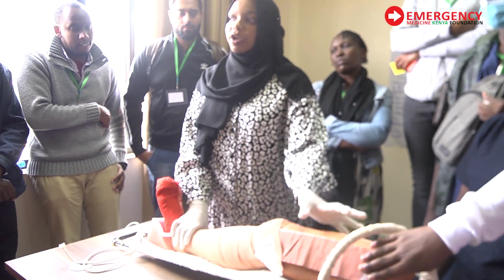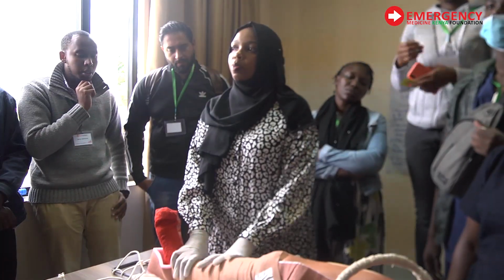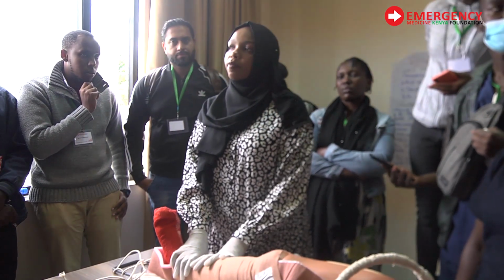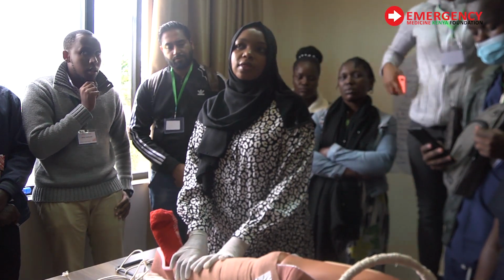No, it's femur fracture. Only femur fracture. You cannot put it for the tibiofibula. That one you just put a back slab or you put your blocks, whatever you have. Okay. Any questions?